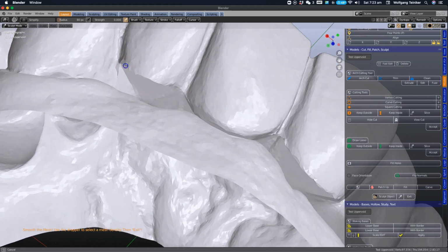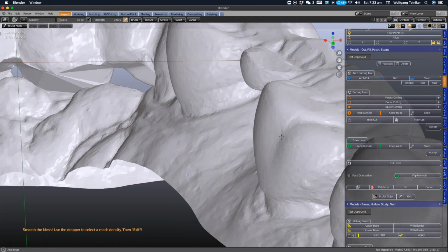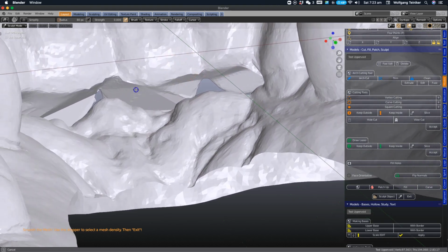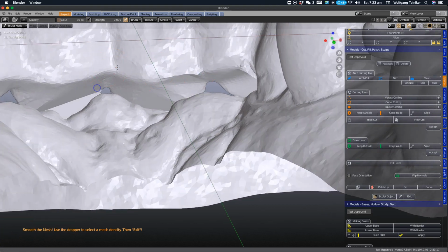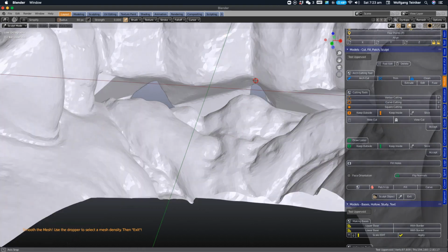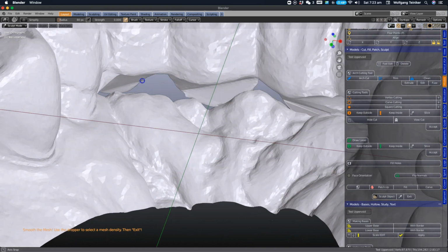And then we're going to connect these pontic areas on the gum, because if you're going to want to print this, you'll need support and everything, so we may as well just join it onto the tissue area. I'll show you how to do that in a minute. Of course you can print it like that if you want. Okay, so I'm quite happy with the results so far.